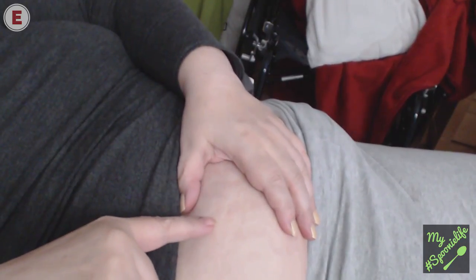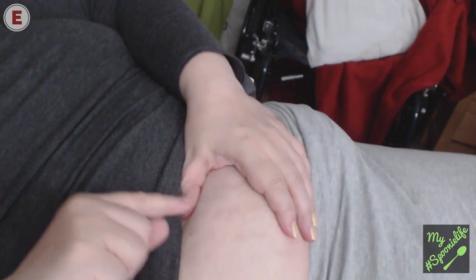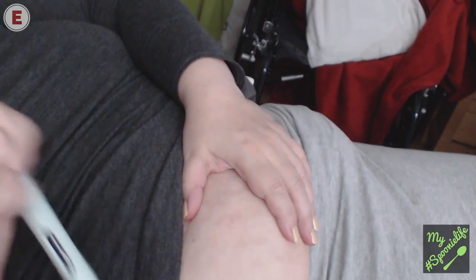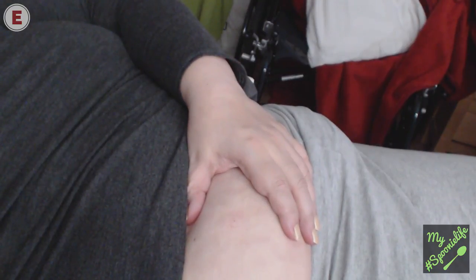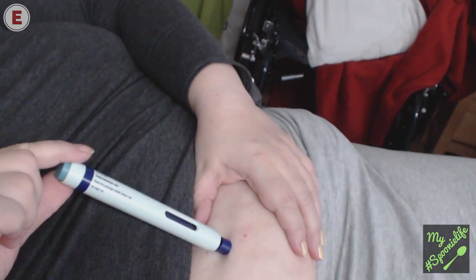And I pull this out. Now I don't know if you can see that, but there is a tiny little bit of wetness — sometimes just a tiny, tiny bit of wetness. Now it's done.